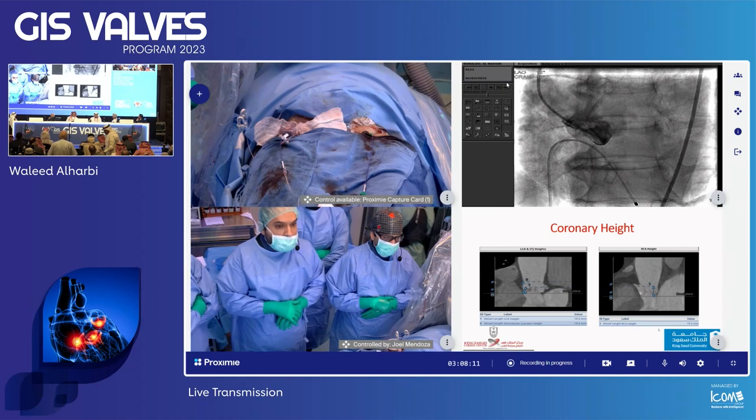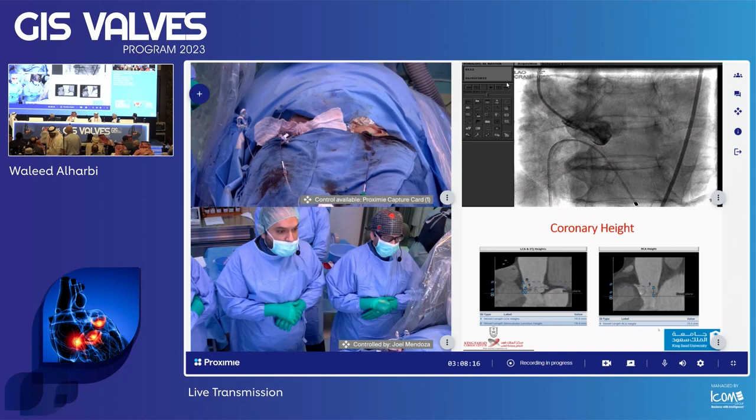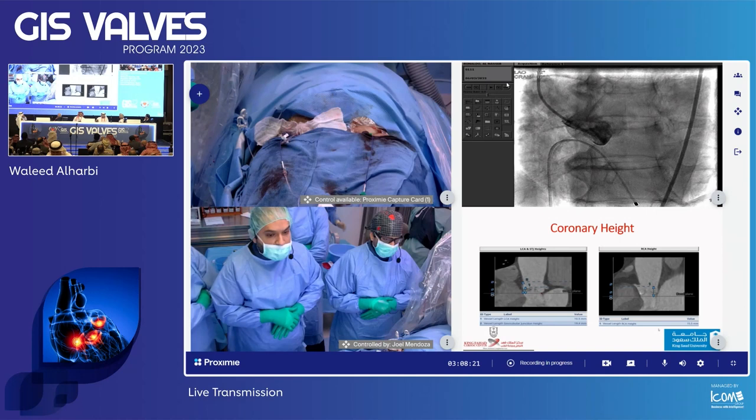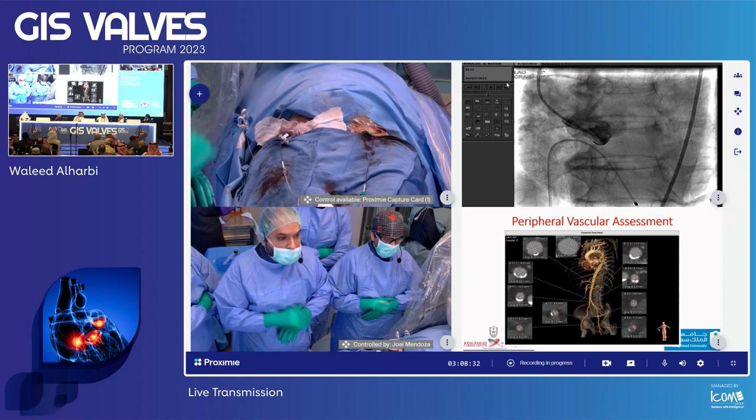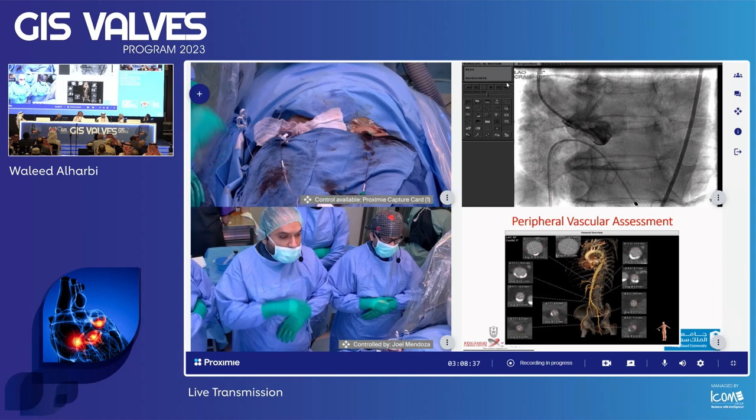An important consideration is coronary height. The left coronary ostium height was 10.5 mm, and the right coronary ostium height was 15.5 mm. Her peripheral vasculature was predominantly adequate, but she had a high bifurcation of her right femoral artery. We chose a permissive diameter femoral artery approach with no significant circumferential calcification.